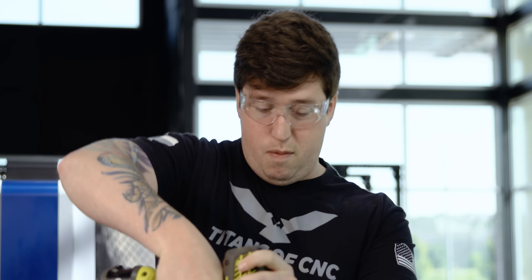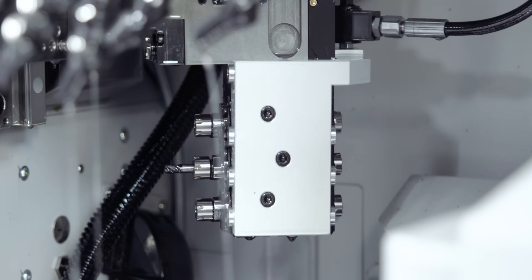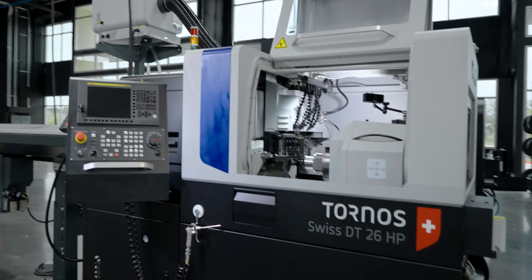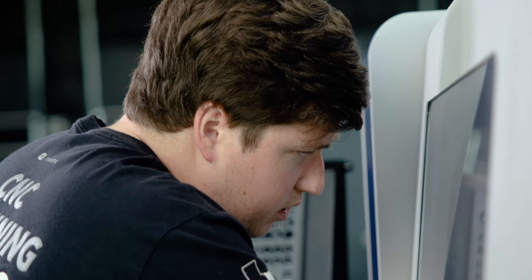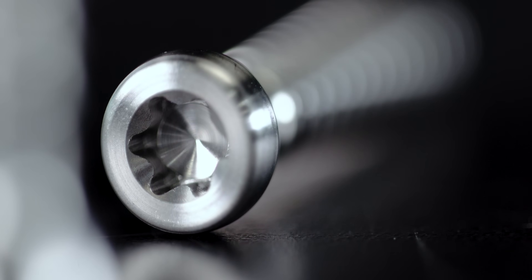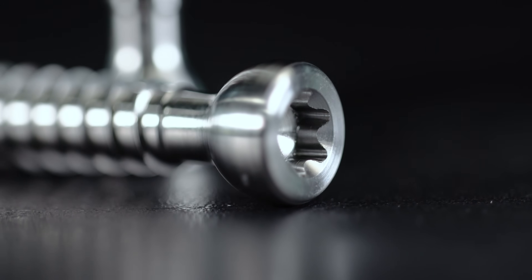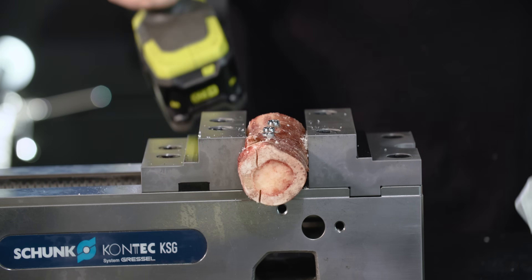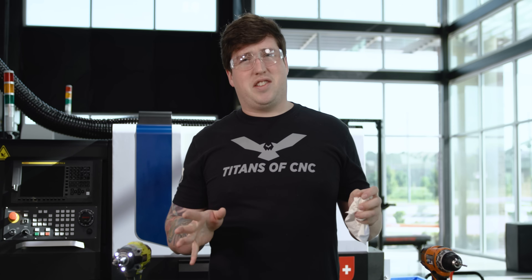Today, I'm gonna show you how the screws are made that hold human beings together. Bone screws need to be made perfectly, and in today's video, I'm gonna walk you through all the unique things I did to make a completely burr-free bone screw. I'm gonna show you a thread process you may have never seen before — it's called thread whirling — and it's necessary to create the unique geometries on these bone screws. And if you stick around to the end, I'm gonna tell you how I wound up with seven of these in my shoulder. It's kind of embarrassing.